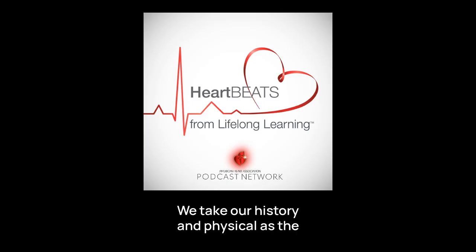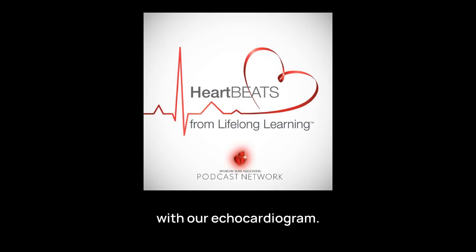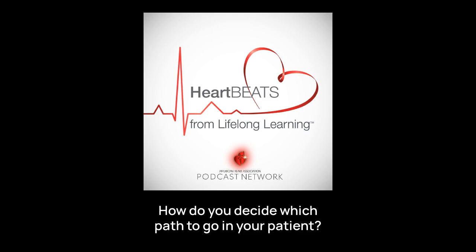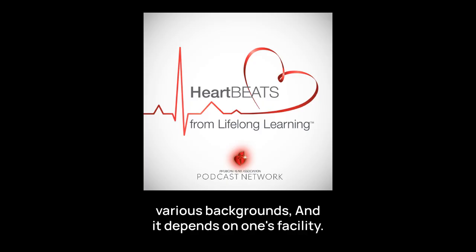We take our history and physical as the top of the funnel. We narrow it down with our biomarkers, narrow it further with our echocardiogram. And then you mentioned endomyocardial biopsy, MRI. How do you decide which path to go in your patient? This is why it's so important to get an expert panel from various backgrounds. And it depends on one's facility.